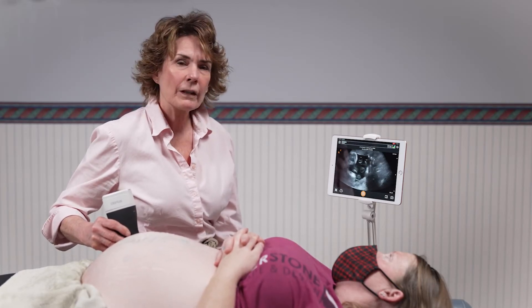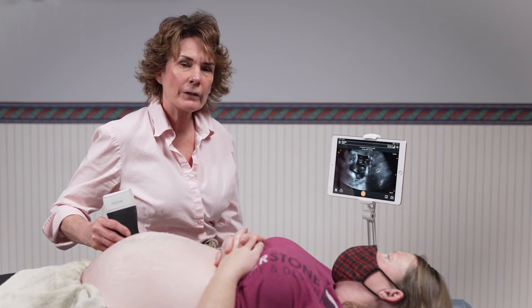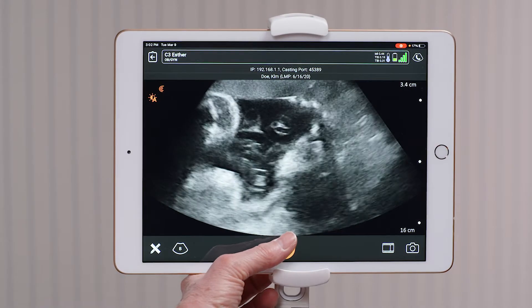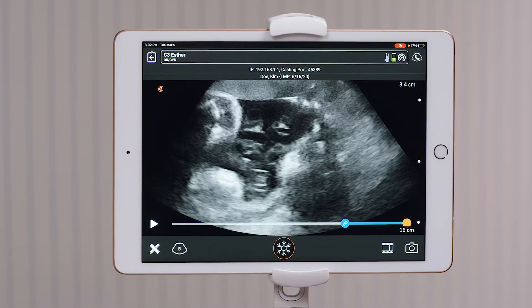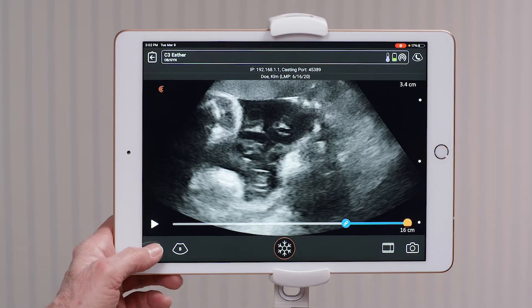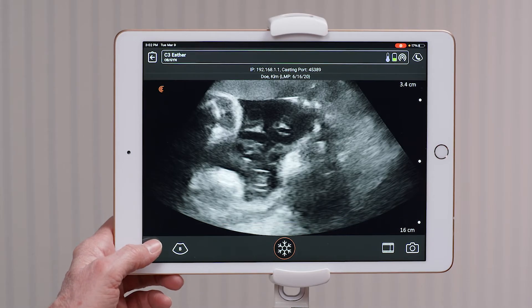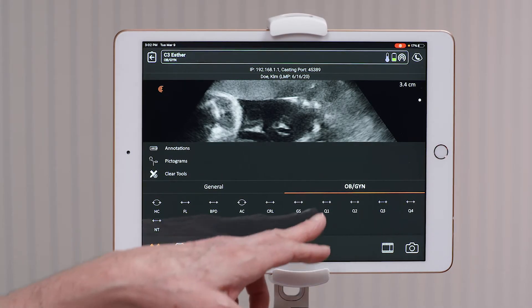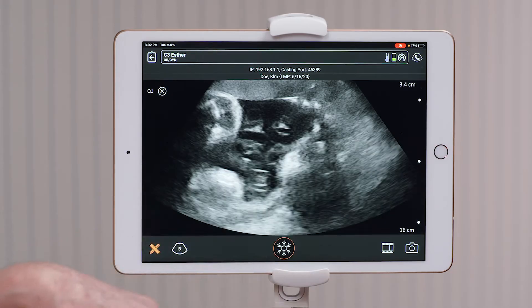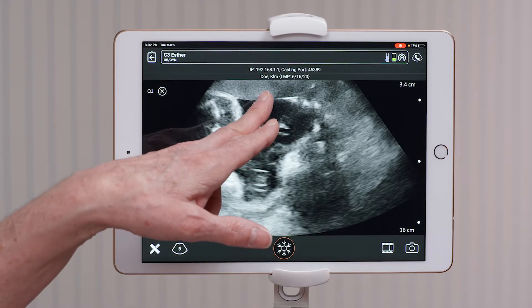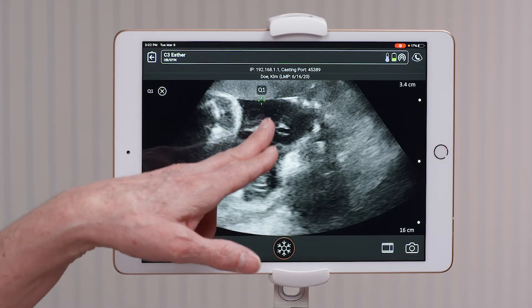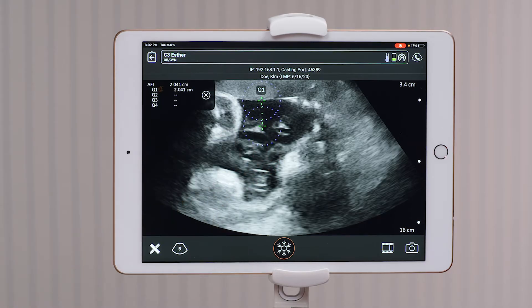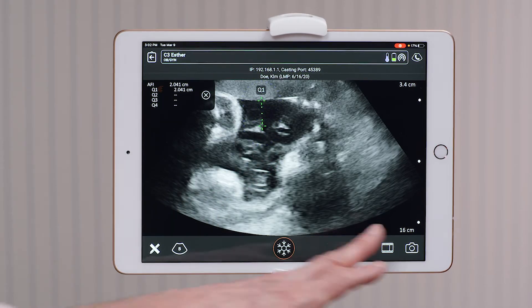Once you have one of the quadrants on the screen, you would freeze the image and bring up your caliper using the measurement tools in the lower left-hand side. I'm going to select quadrant one and measure this pocket of fluid, not to include the umbilical cord. I would take a picture.